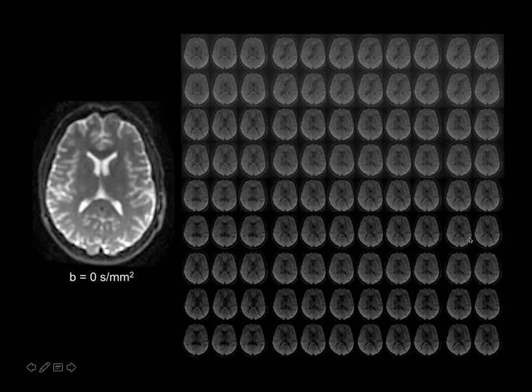So one of the things about that type of data is there's nothing for free. So if you want to do some of these algorithms, then you have to acquire many, many more volumes of data. And even with that, there's still quite a bit of literature out there, even more recently, that shows some of the issues with the inaccuracies of tractography.